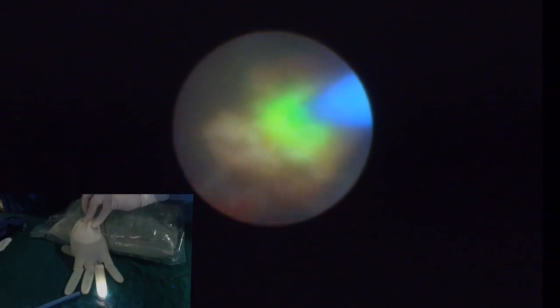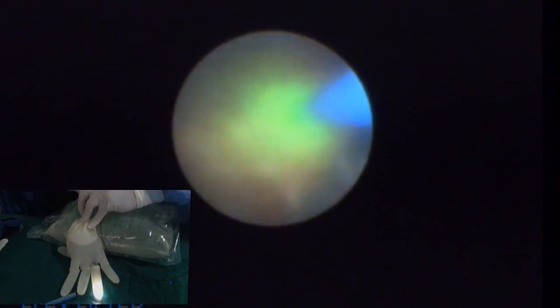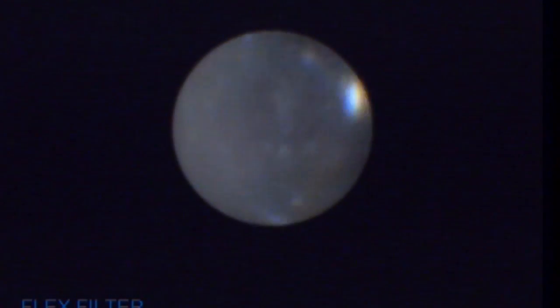The laser fiber is advanced and the stone is fragmented. With micro-PCNL there is no stone extraction, so the fragments have to be small in order to pass through the ureter.